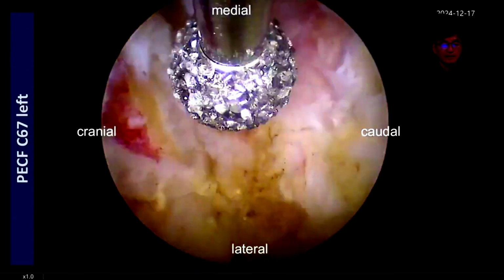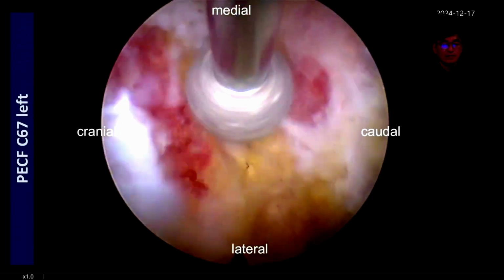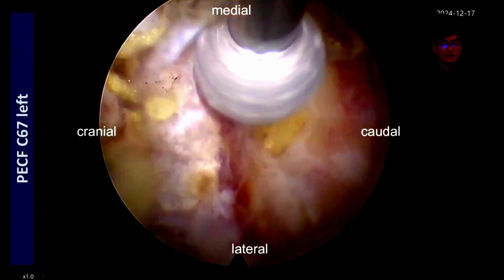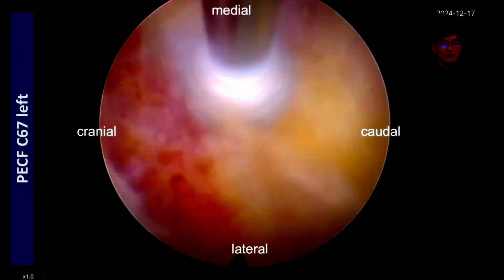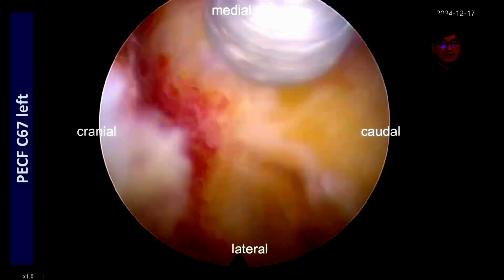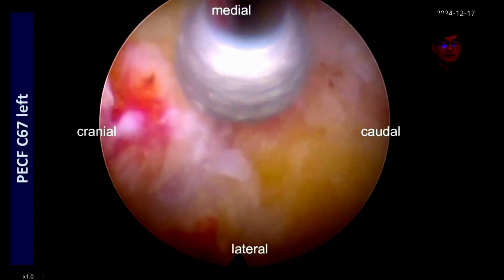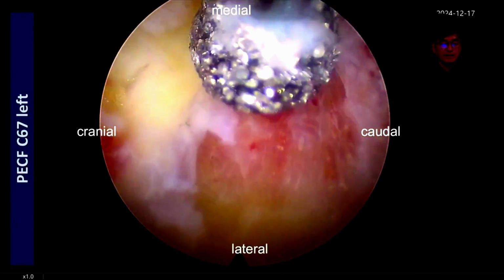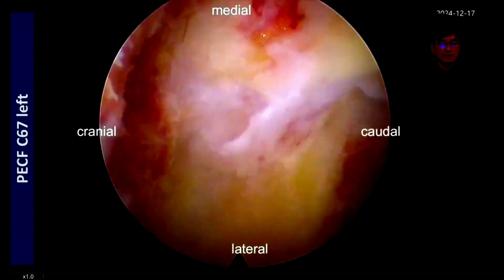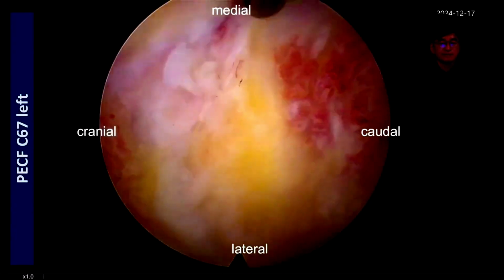So likewise, in the lumbar spine, it is very crucial. Don't waste your time preparing all the soft tissue, right? Once you identify the inferior edge of the cranial lamina, bring the scope, remove the bone step by step, and then identify the V point. Then you can see some sort of the medial facet joint there.